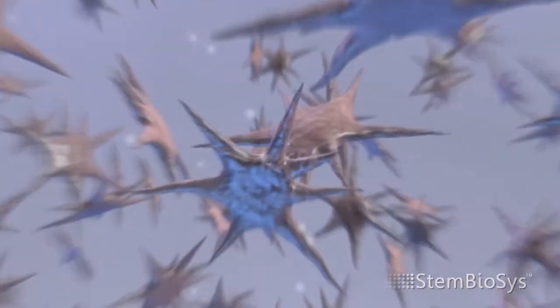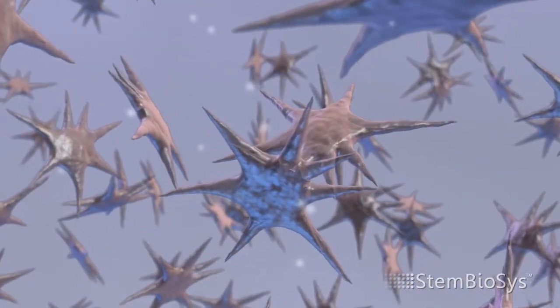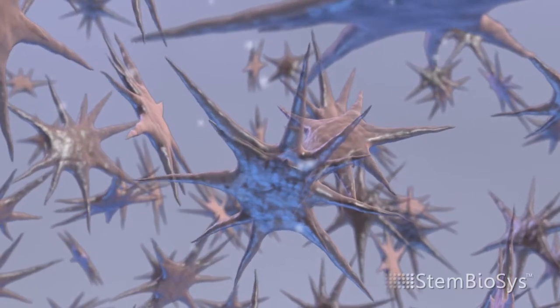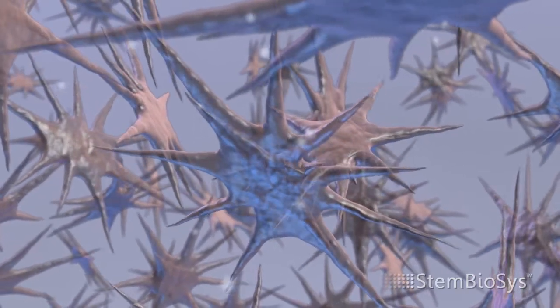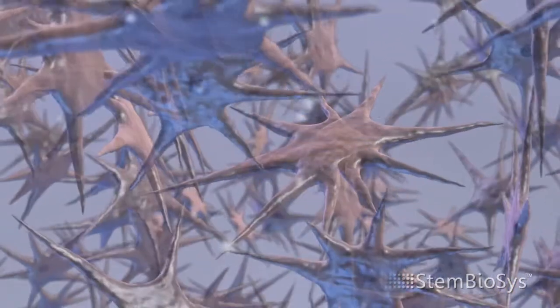We add a proprietary culture medium, and the cells begin to divide, increasing cell numbers and fully covering the surface of the dish or other culture substrate.